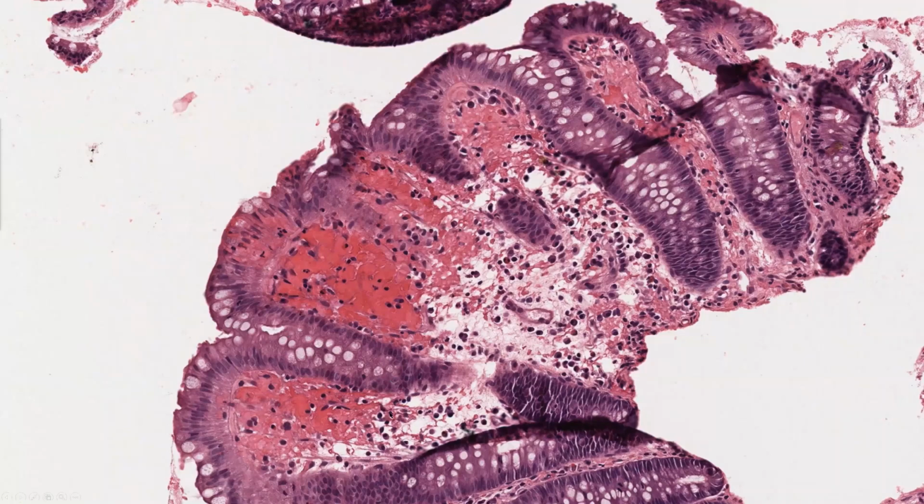But a lot of other people, and we saw this area in the same biopsy at low power, that there is edema, but it was focal. You see, it wasn't the entire biopsy that was edematous. It was very focal. And here, instead of the red blood cell extravasation that we saw before, we have definite areas of lamina propria hemorrhage, right? And all of these together, when you put them, these are all features of ischemia.